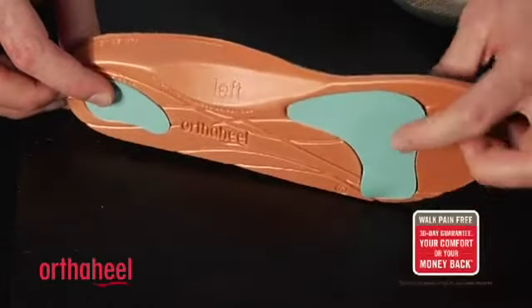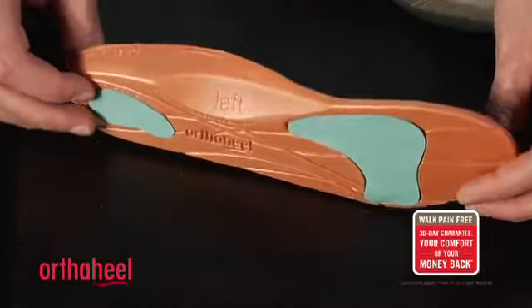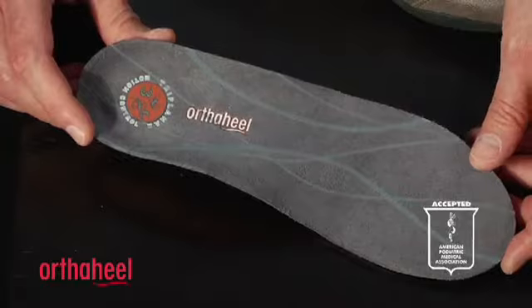We have two shock absorbing sections in the heel and the forefoot to help with cushioning. The orange material is EVA, which is a type of foam that's lightweight, cushioned and shock absorbing.